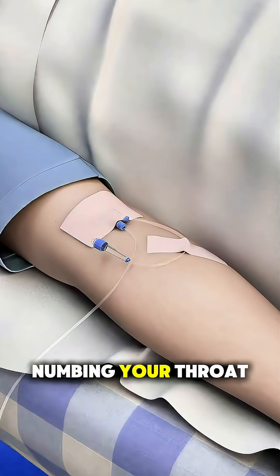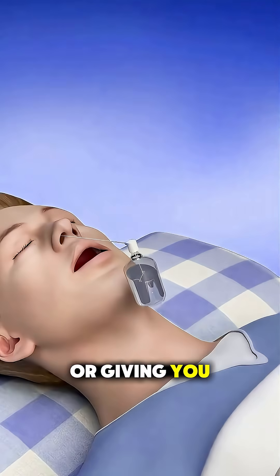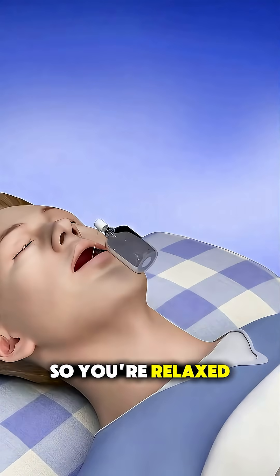It starts with numbing your throat using a spray or giving you light sedation, so you're relaxed and comfortable.